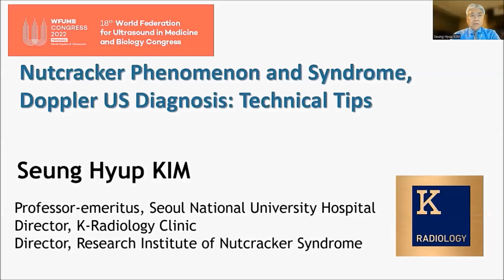Hi, everyone. It is my pleasure to share my experience of Doppler ultrasound diagnosis of the Nutcracker phenomenon and syndrome. And specifically, I want to share technical tips and know-how in doing Doppler ultrasound of the Nutcracker.